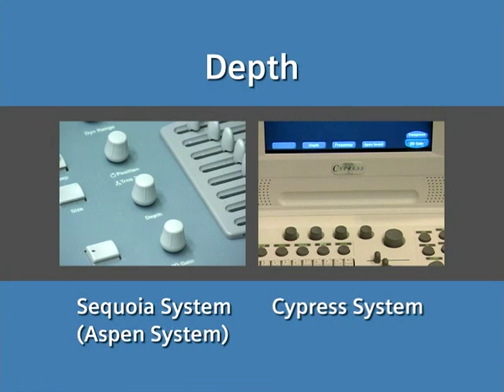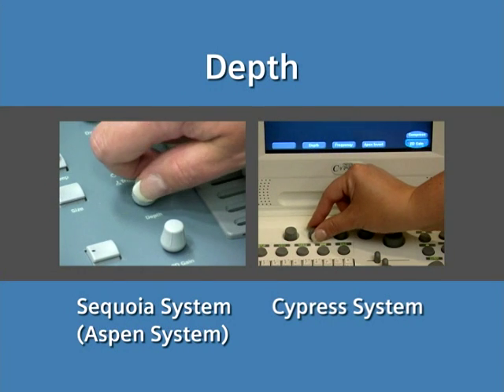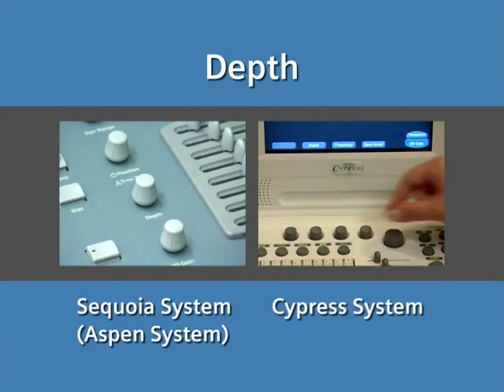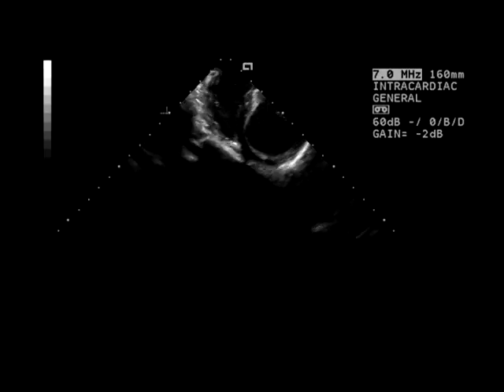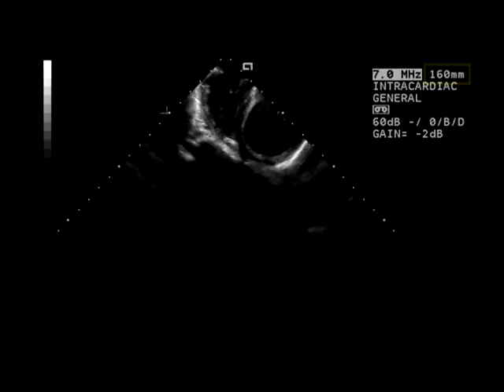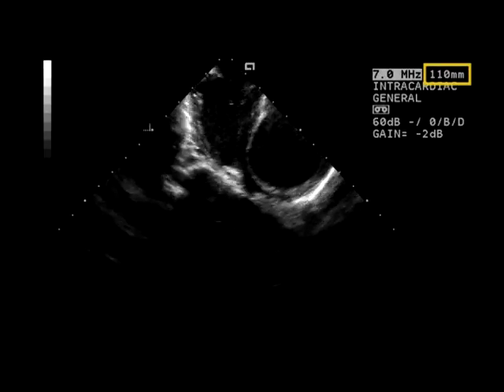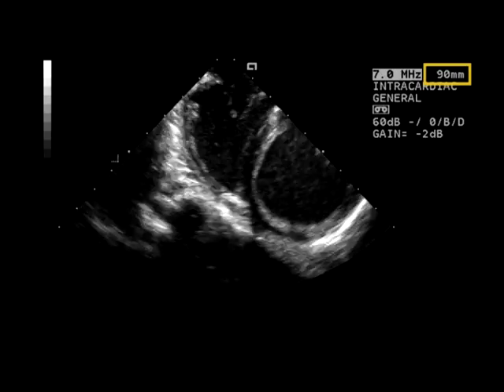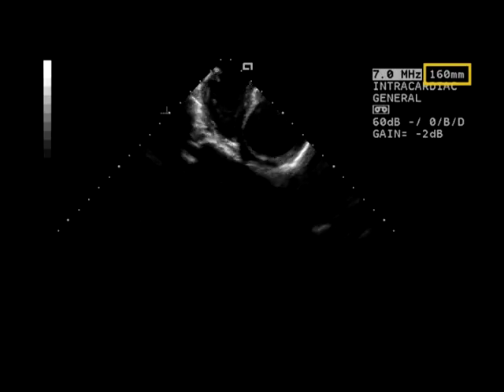Depth. The Depth knob increases or decreases the field of view. The appropriate depth setting will depend on the image view, the size of the heart and patient, and the location of the desired imaging target.